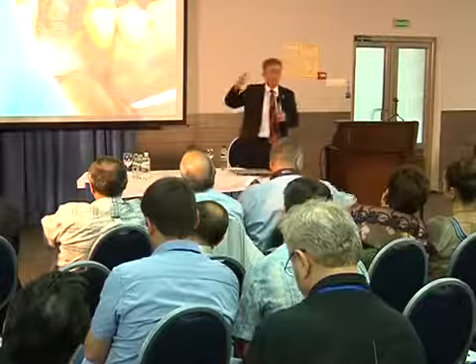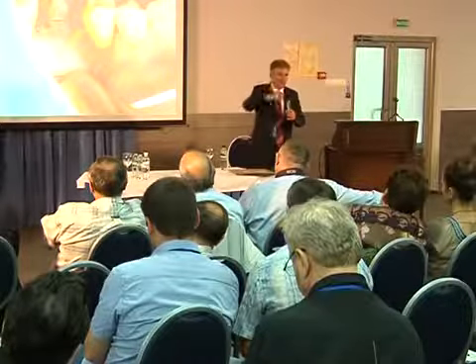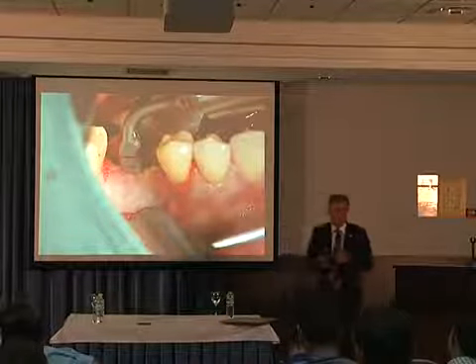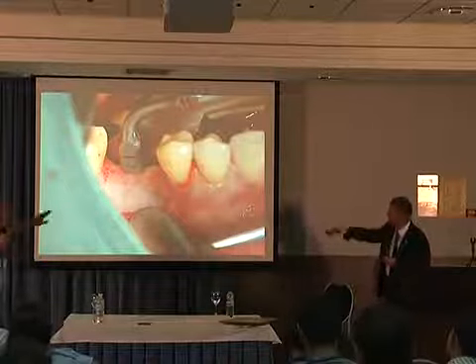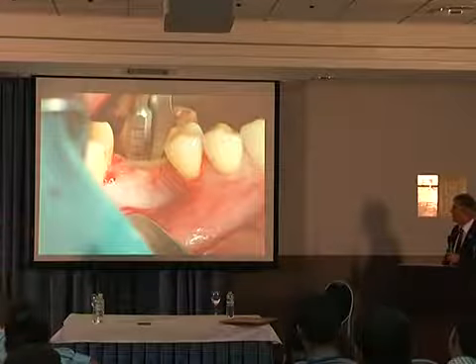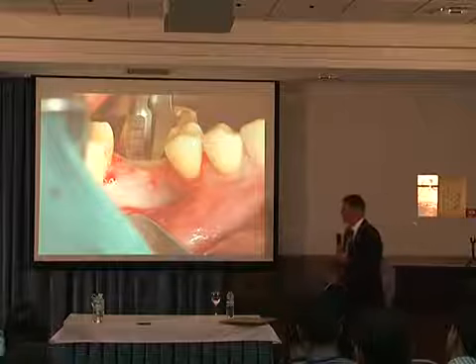This must work with a lot of saline. Here is no saline because of the photo, but when you work, a lot of saline. Yeah, if you do it without saline, it smells like bone. It was bone before. Yeah, then you destroy. Когда вы используете вот такие наконечники, он извиняется за то, что здесь нету, вы не видите водяного охлаждения. Водяное охлаждение убрали только для того, чтобы сделать фотографию. Естественно, когда вы идете пьезоинструментом, вы пользуетесь водяным охлаждением.